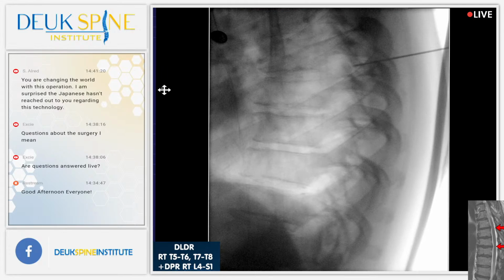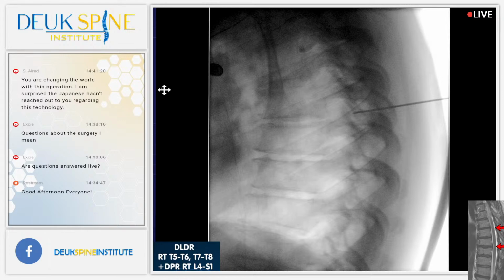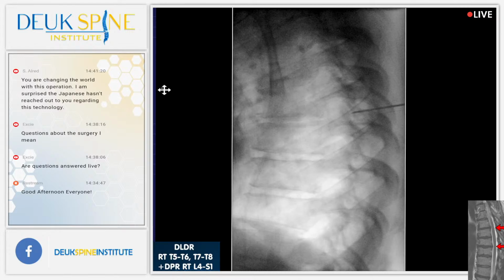All right, let's see if we can't get a little bit better picture of that disc. You're going to have to center the fluoro higher, go up more north. Cut out some of the stuff in the back that's giving us overexposure. Darken up where we are. Shot. That's better. All right, so you can see the disc space. You can see the facet. It's a little bit overexposed, but I can actually feel the facet, which is what I want to feel. And I want to work my way around it.